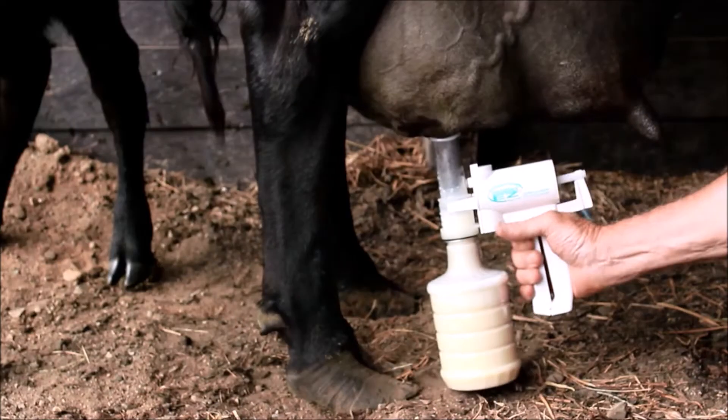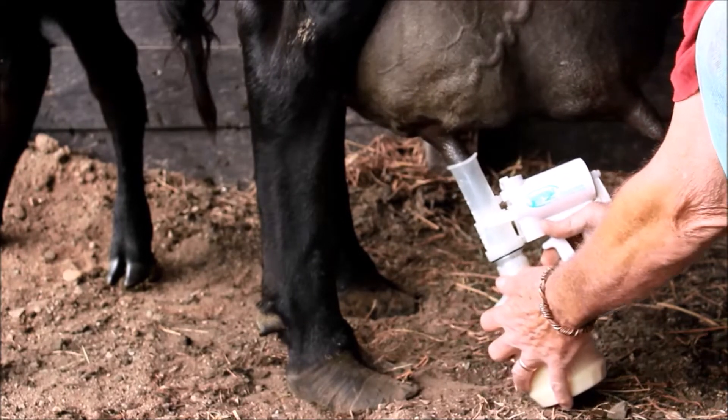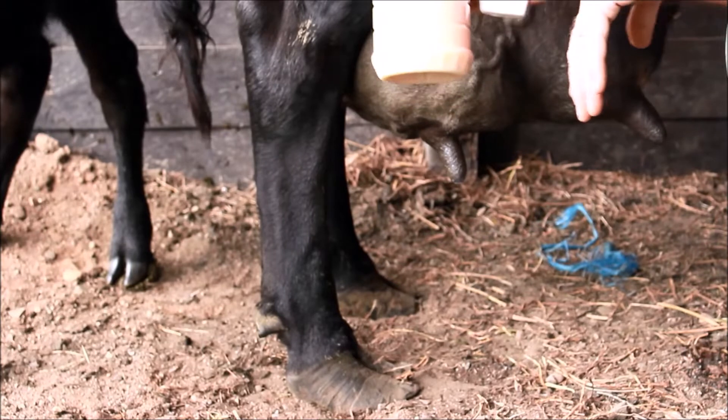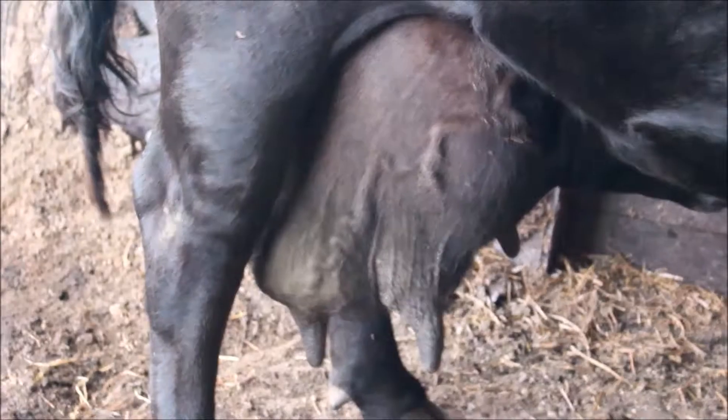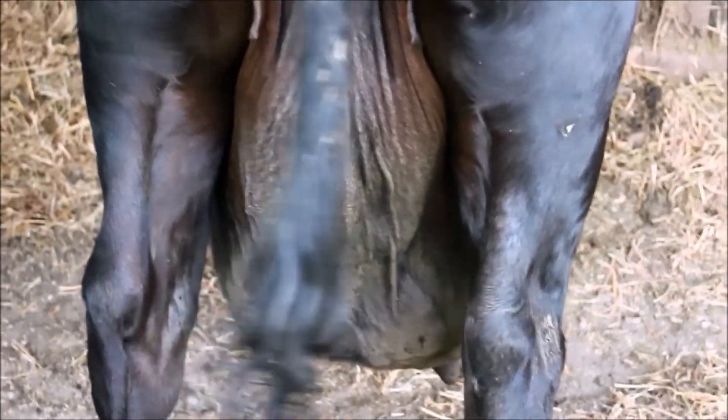Okay, push the button up — we're backing up, so I'll just release it. We don't want to get milk into the pump. We got a full quart of colostrum. The major difference in this bag now — we've gone ahead and pulled all that milk out of her and a lot of the mastitis, so you can readily see how much that went down compared to this morning when we started on her. We're getting there.